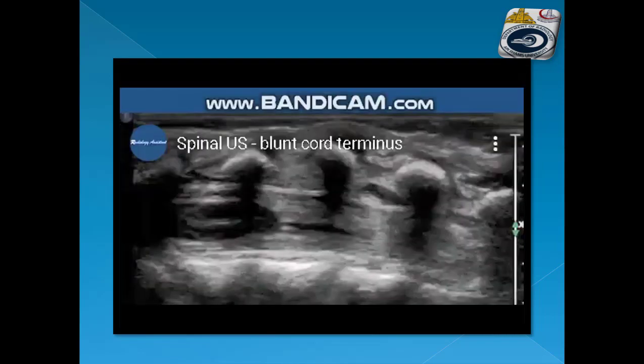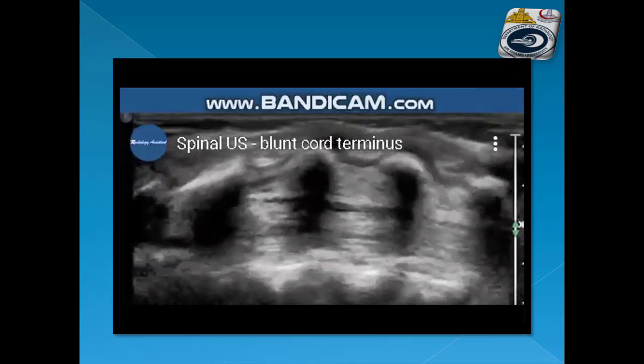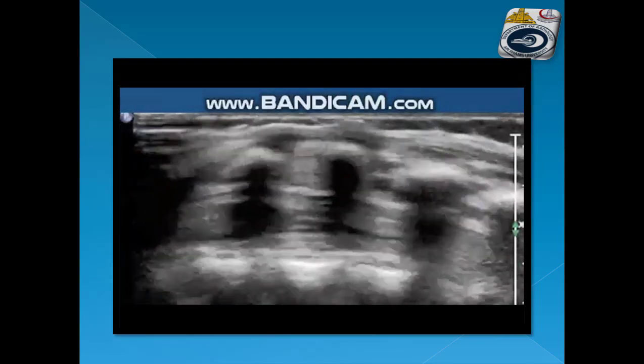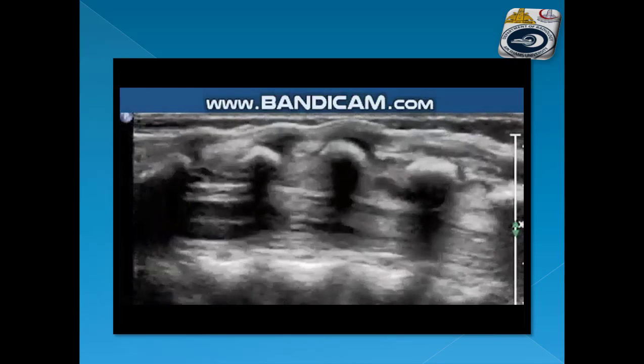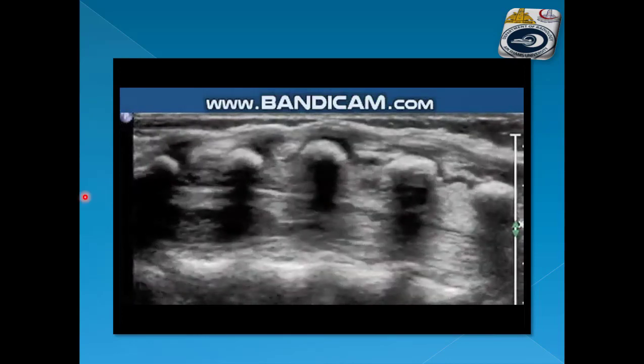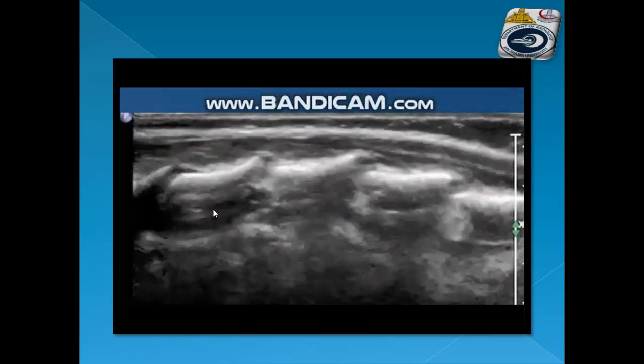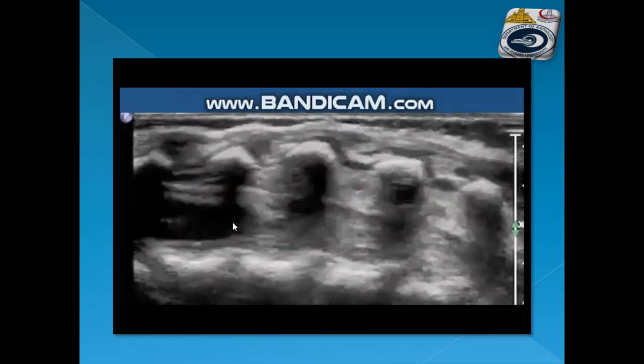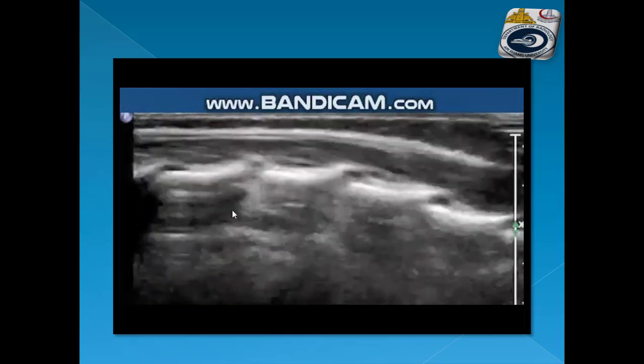Another example of blunt cord terminus showing the termination of the cord with abnormal shape.